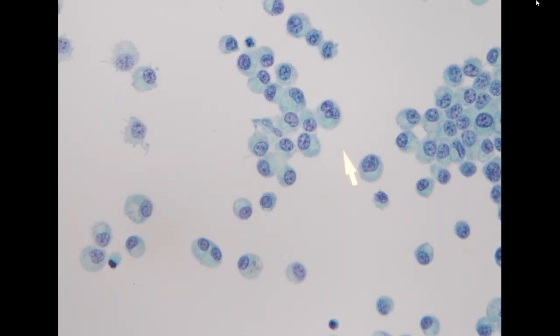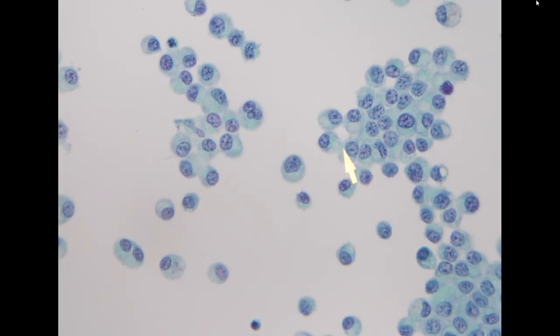And if we go on high power, the majority of the cells have a plasmacytoid appearance, which looks very much like a plasma cell, because you also see some pale perinuclear area, looking like the Golgi zone. And the chromatin pattern, we would call a soccer ball pattern, which is also quite often seen in a plasma cell.